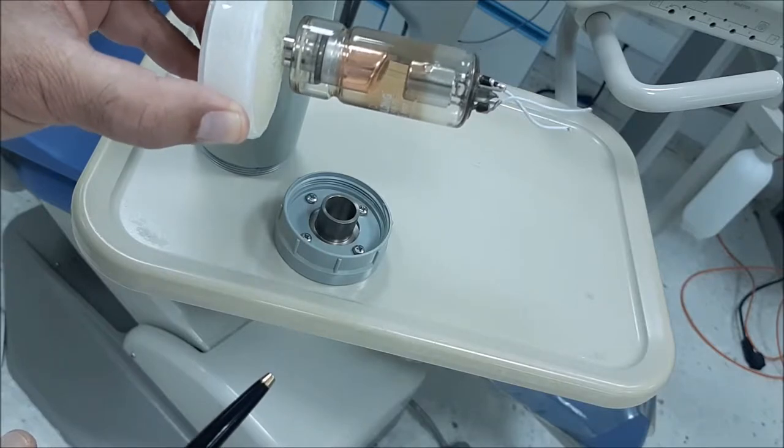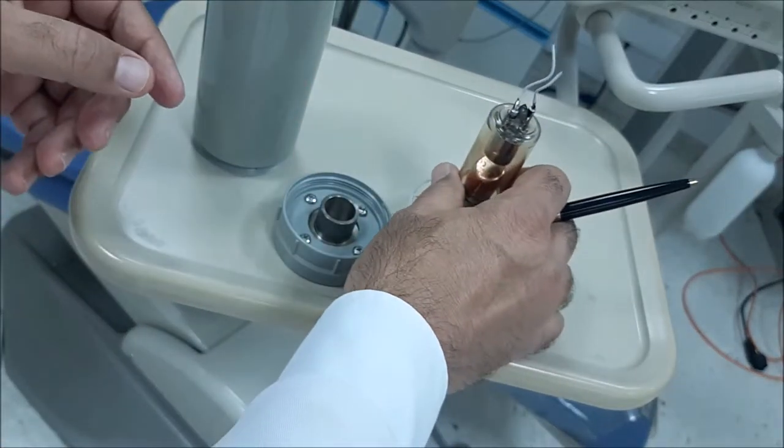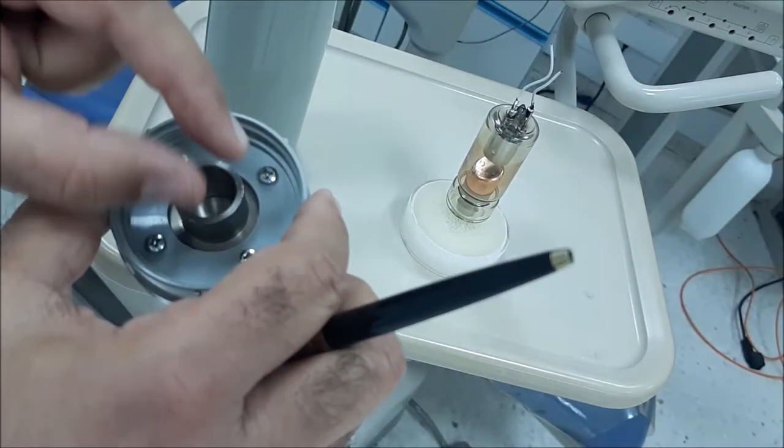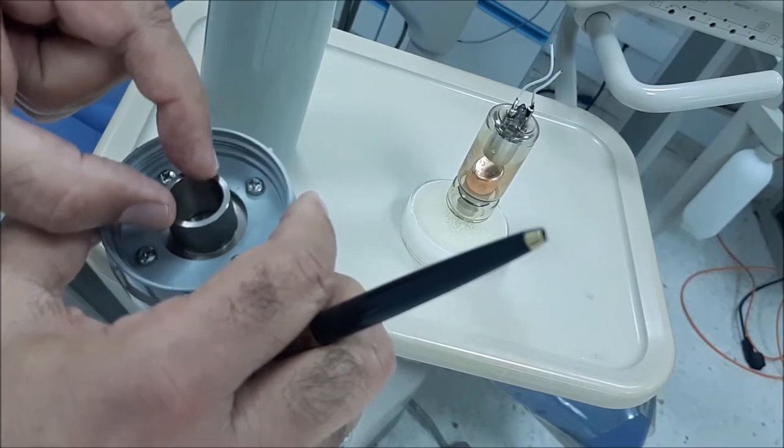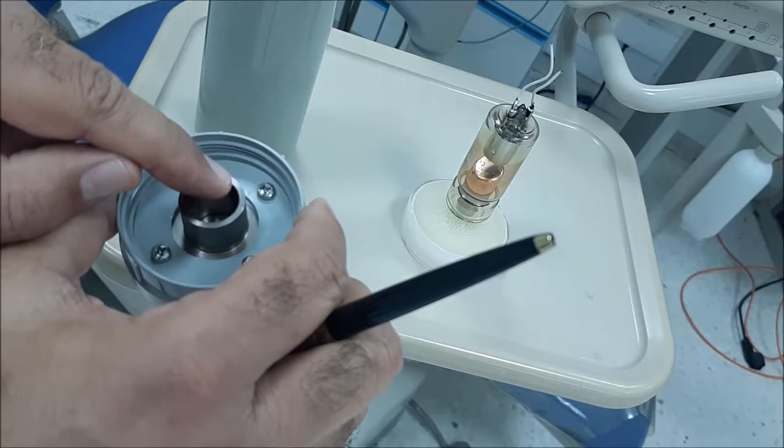In reality, we don't need this very big beam. We only need 6 to 7 cm diameter of a circular beam to reach the patient. This is equal to the size of the sensor that is placed behind the tooth.